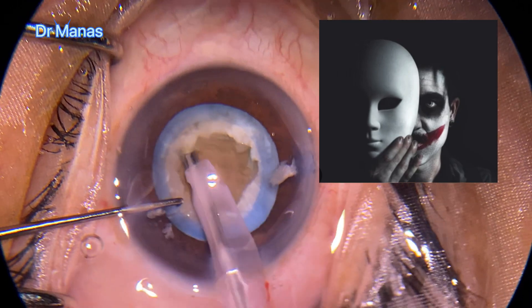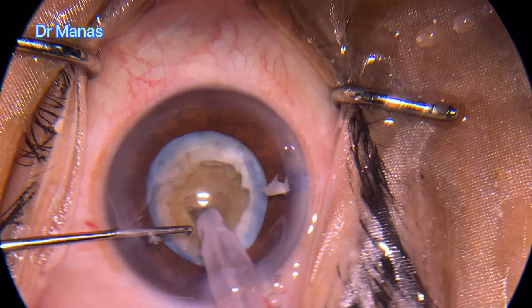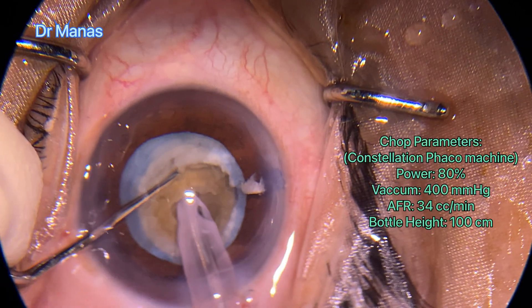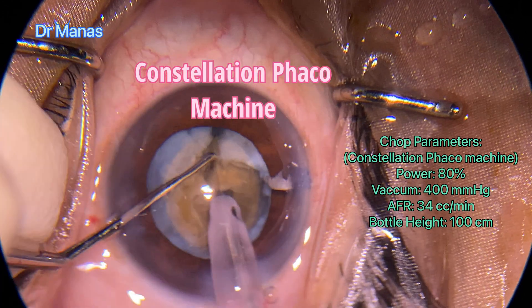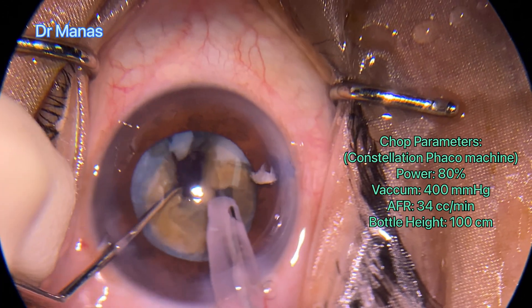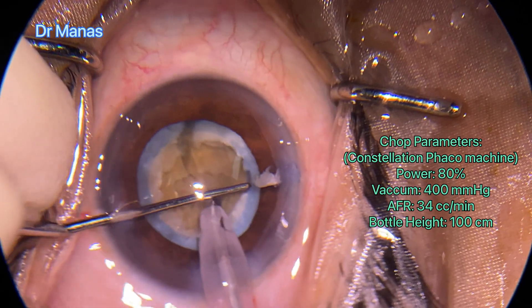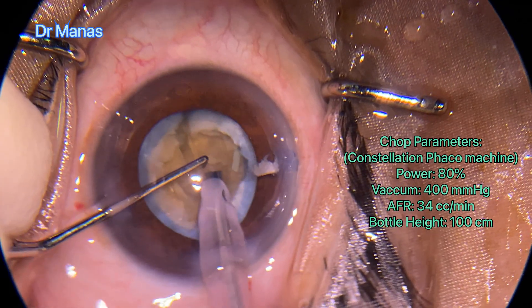It's a very dense, hard cataract. I started my phacoemulsification with the Constellation machine with the parameters mentioned here. It's a very dense cataract — even rotation was quite difficult.